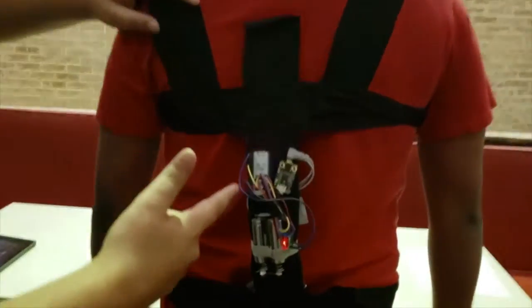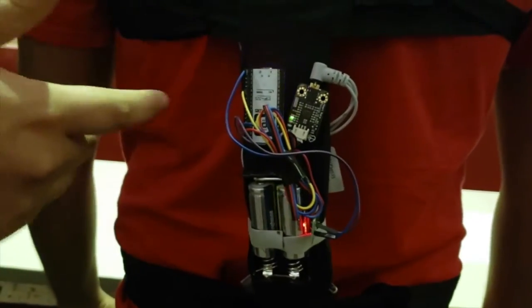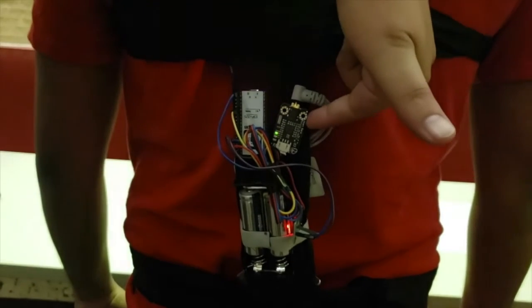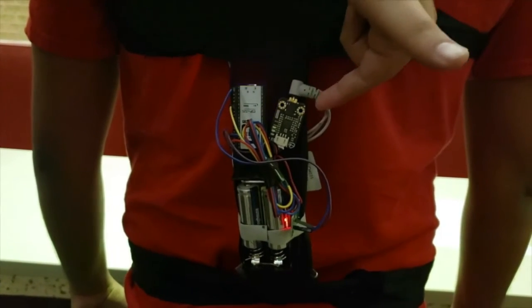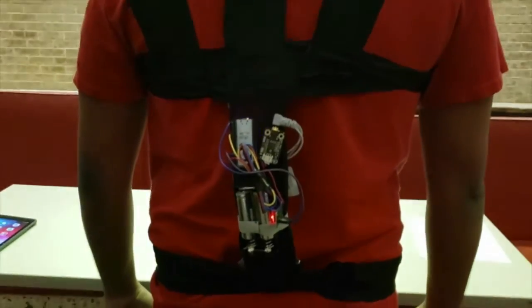Here in the back you can see our microprocessor, and that's what houses our analog to digital converter, which converts the signal from our ECG sensor and sends it to the microprocessor, which then sends it to our app wirelessly through Wi-Fi.